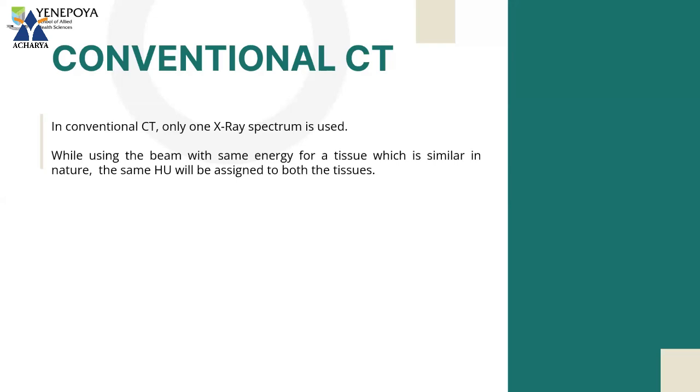But when the X-rays pass through the human body, they pass through a lot of tissues with different densities for a given position, making it extremely difficult to understand the interaction between photons and matter.